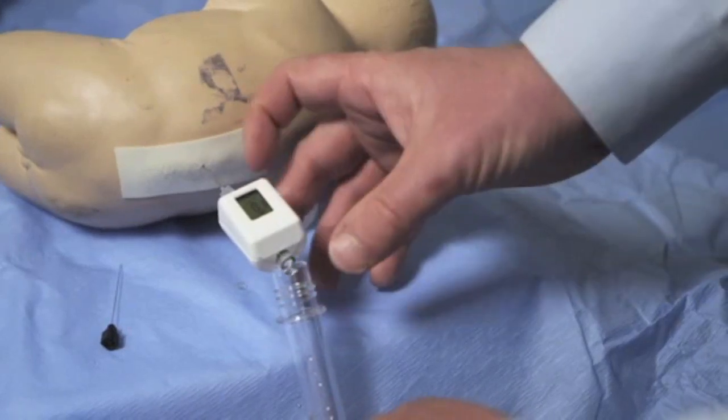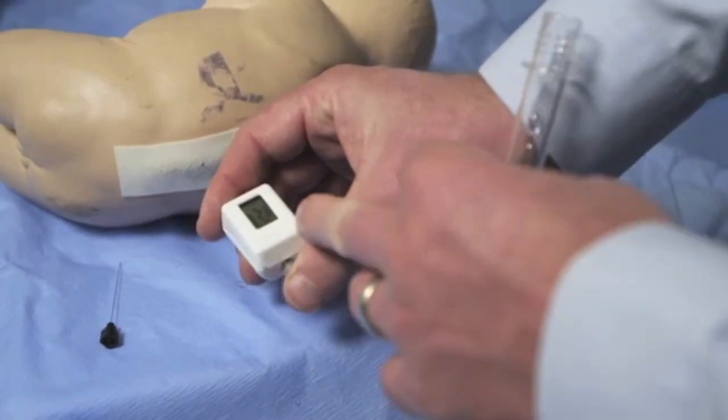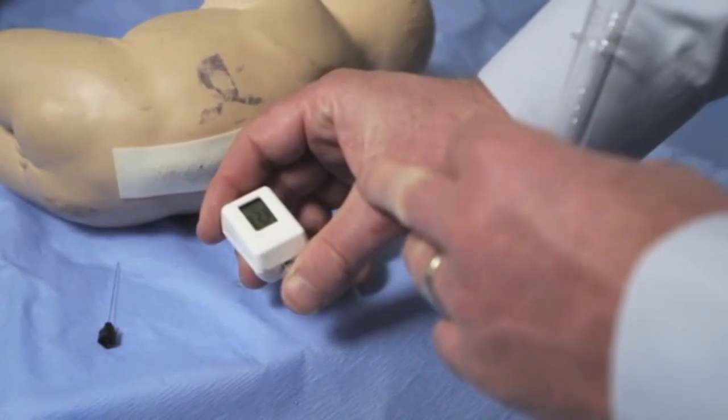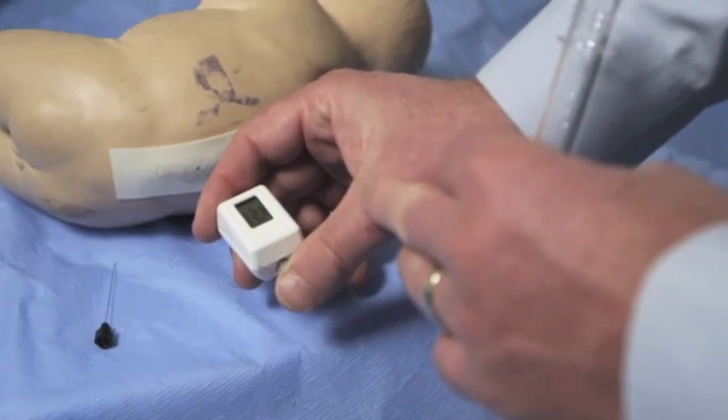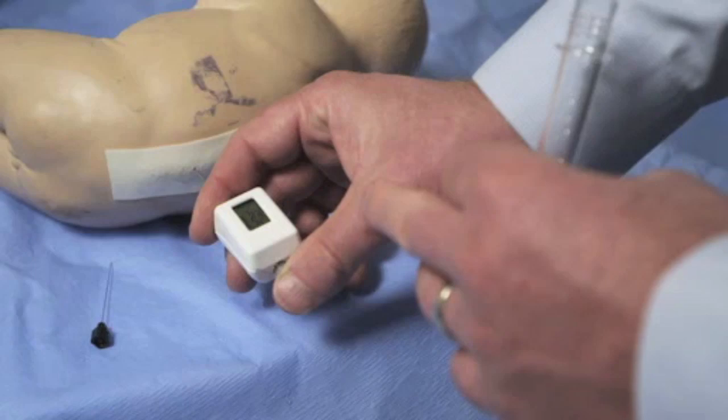At any point while collecting CSF, if the rear portion of the Compass is covered, another pressure can be obtained, which makes it very convenient when performing therapeutic taps or if the closing pressure is needed.